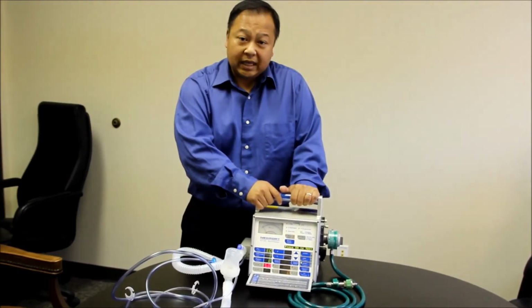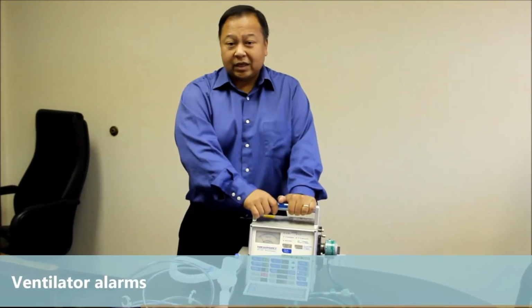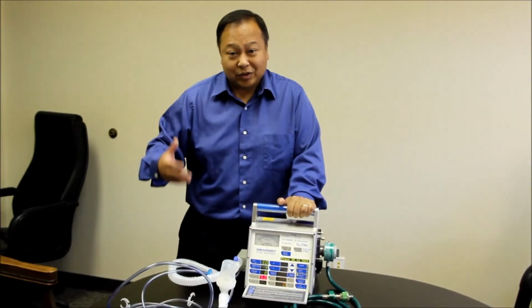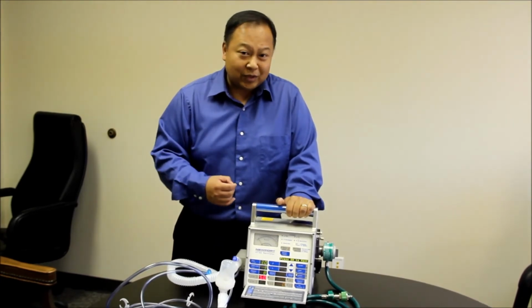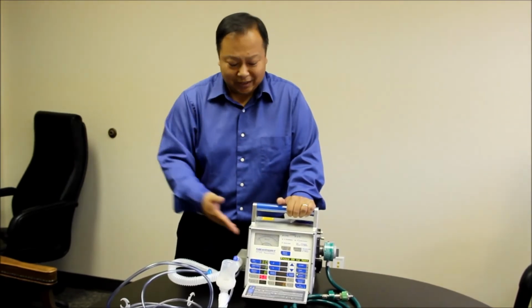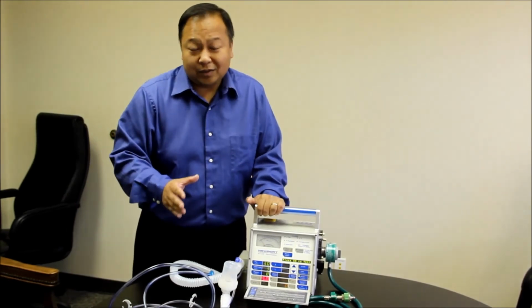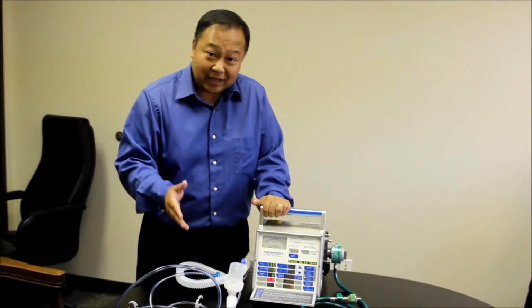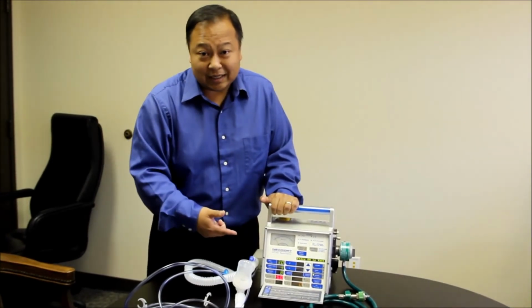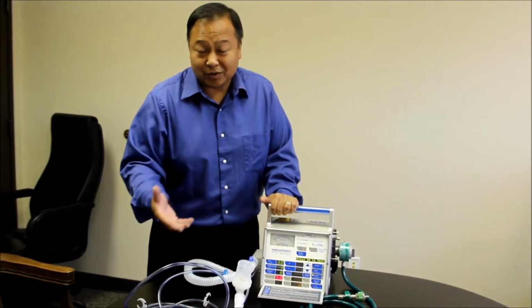The other question that I always get, that I like to explain now, is alarms. When a ventilator alarms, the first thing that the nurse wants to do is hit the silence button. Each time we introduce a new ventilator to a hospital, the first question I always get from nurses is, where's that silence button so that I can press it when the ventilator goes off? And I tell them all the same thing: don't worry about that, you'll find it eventually. The reason the alarm is there is so that you can do something. Hitting the silence button doesn't help your patient. It just silences the machine, which we don't want. That's why the alarms are there.